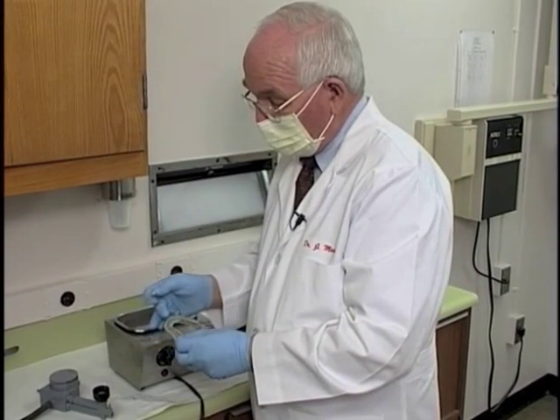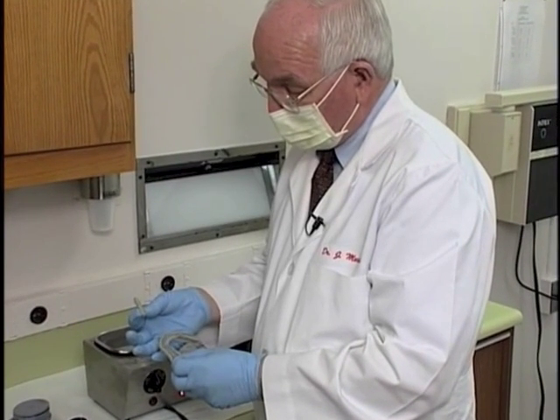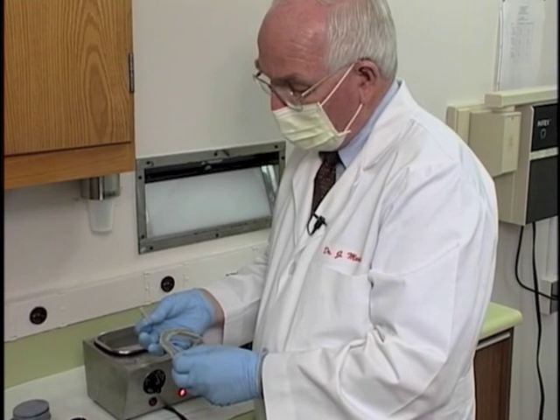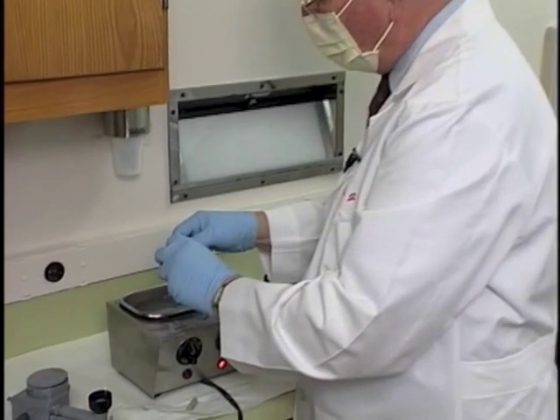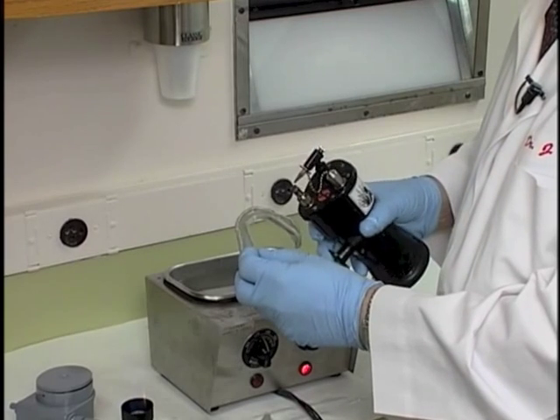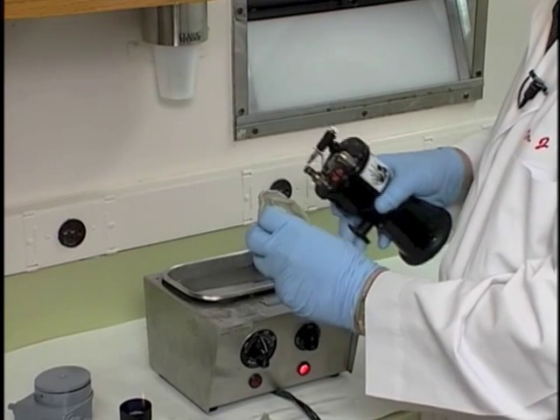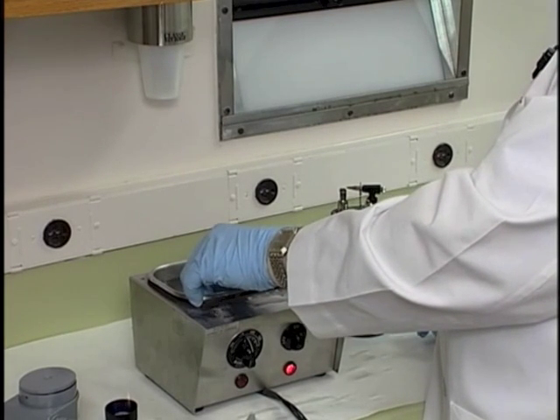And now you notice we've got all the compound around the labial, and notice we still have left a little bit of that 1 stick of compound that we used for border molding the entire lower. It doesn't take several sticks of compound to border mold 1 tray. 1 usually will do it. So now we're going to superheat the material again. Get it nice and soft. Temper it 3 to 5 seconds.